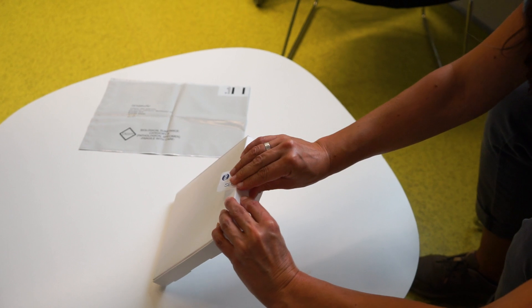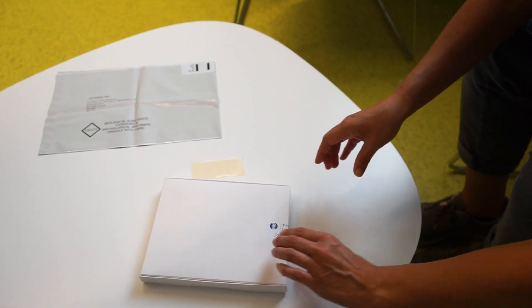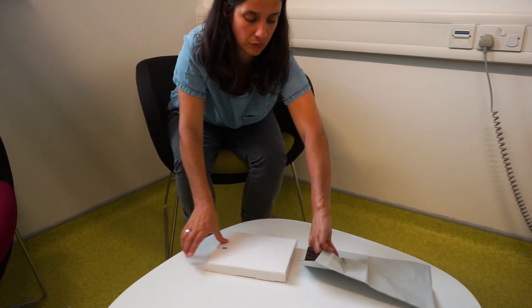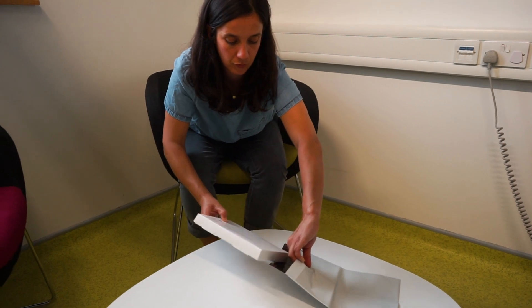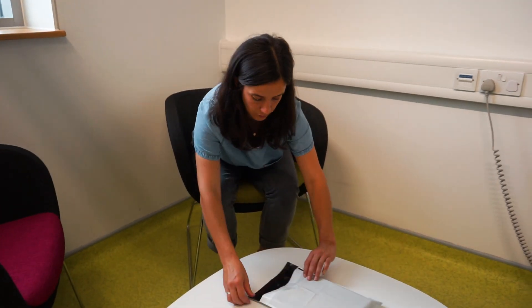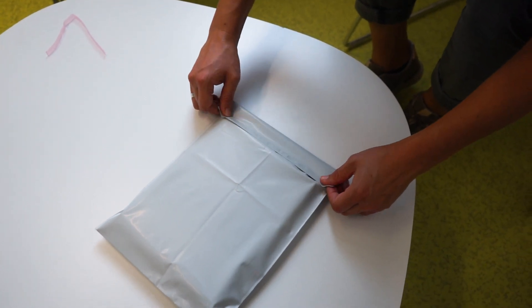If you've decided not to test for HIV and syphilis, please check that you've labelled everything accurately and clearly. Remember, samples which are not labelled properly may not be processed and you may not get accurate results. To return your sample, seal the white box with the security sticker and place it in the prepaid mailer envelope and then pop it into any post box.